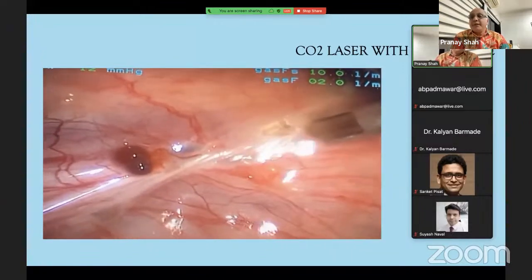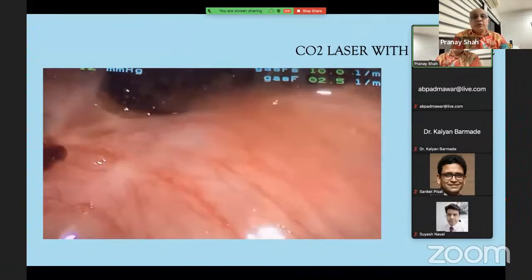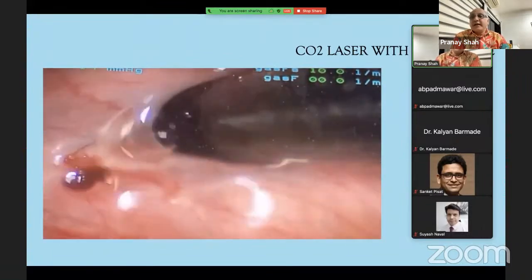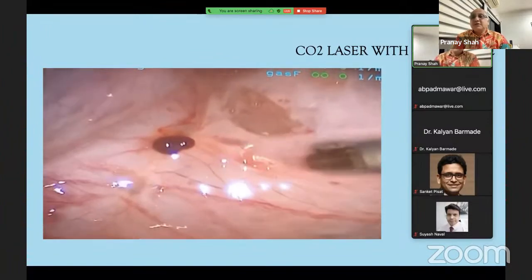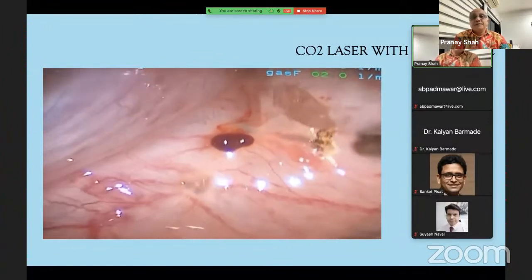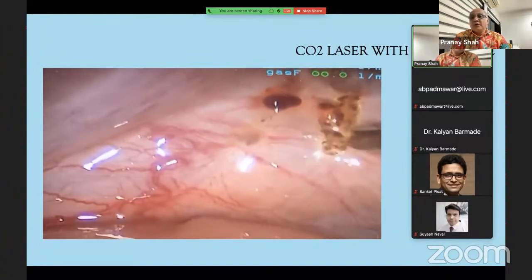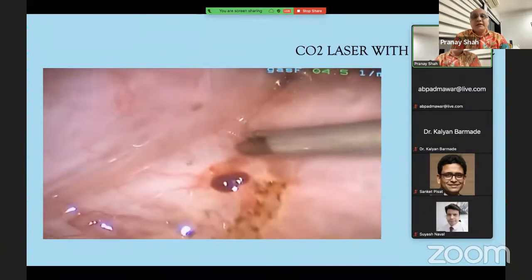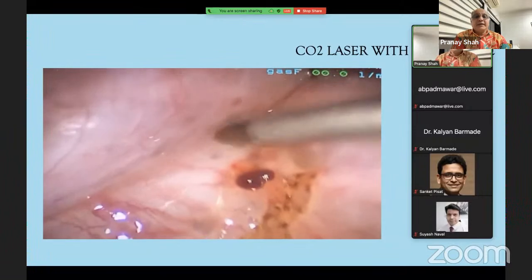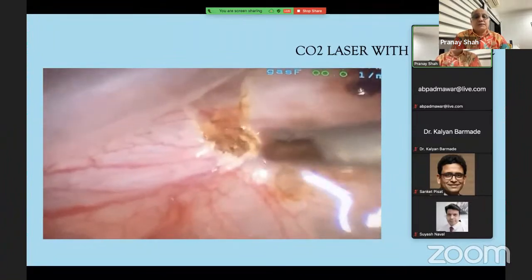If the endometriotic implant is near a vital organ, saline is injected subperitoneally. As carbon dioxide laser is absorbed by water, making it ineffective, the underlying structures are protected. The endometriotic implant can then be excised without the risk of damage to the ureter, bladder, or rectum, which lie underneath the implant, making this a very safe alternative as compared to the other energy sources.